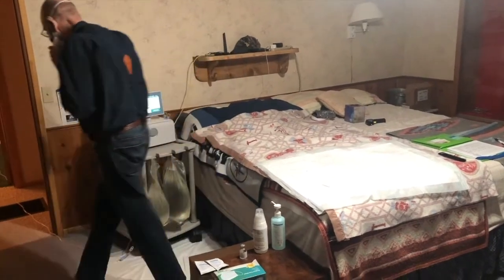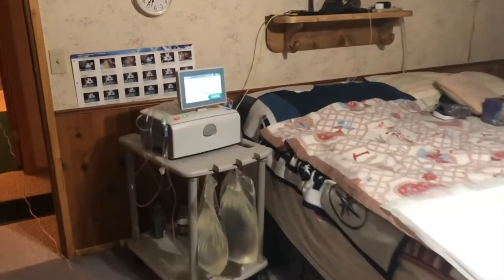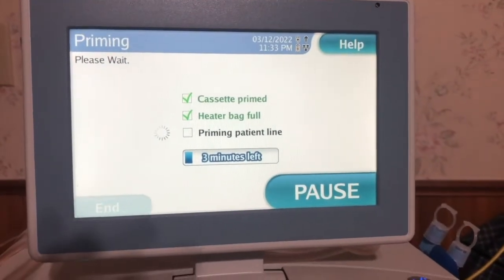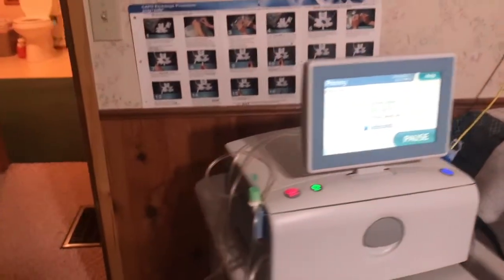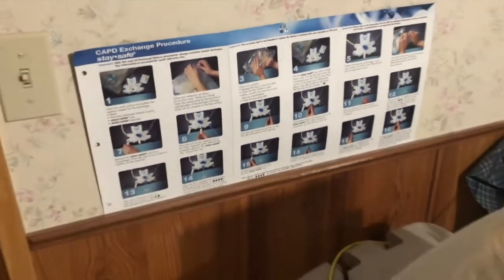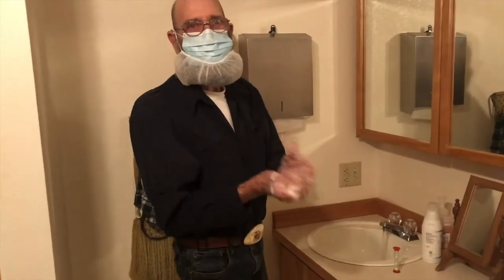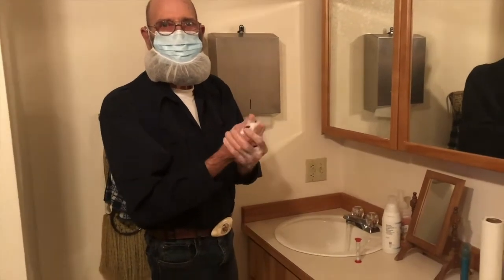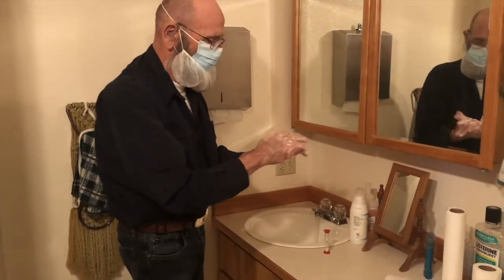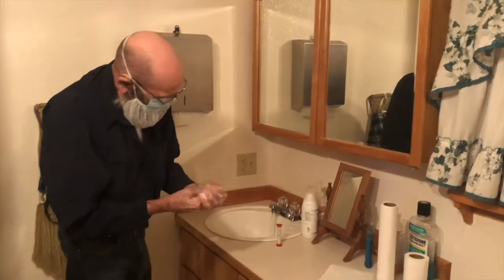Hey Patrick, you gotta wash your hands for 2 minutes with this special soap. You've got an egg timer here that gives you 2 minutes. Scrub between your hands and the backs of them. Get your hands really good and clean with a special soap. You do that until all the sand falls out of that little bottle. So it's almost there now.